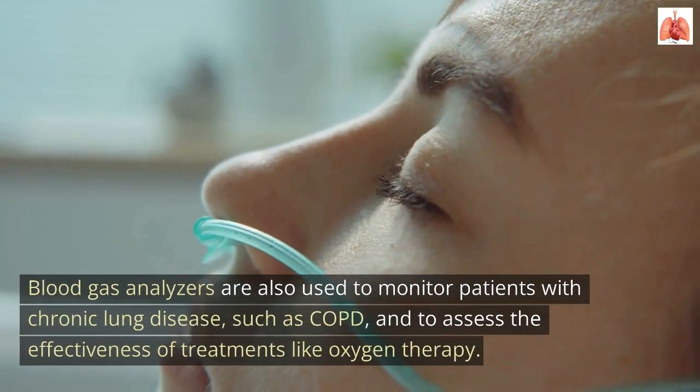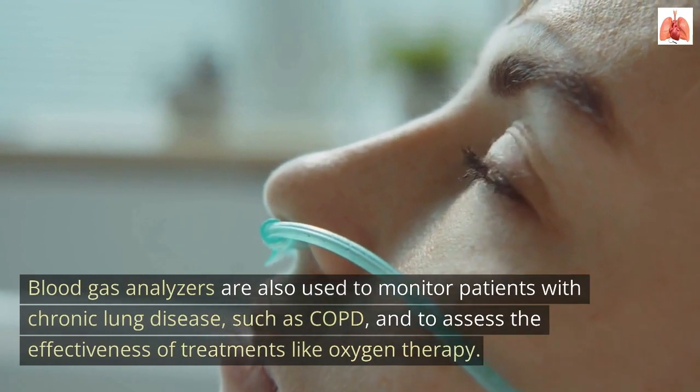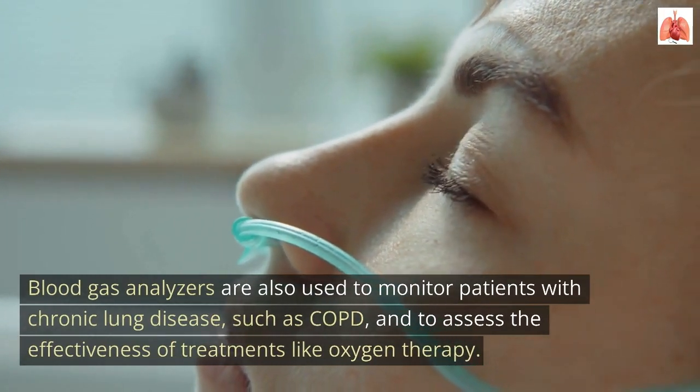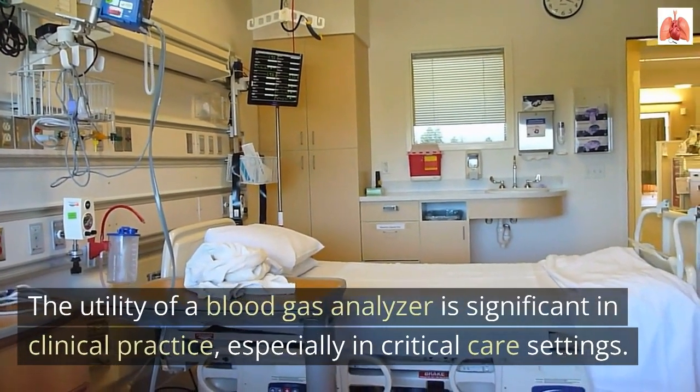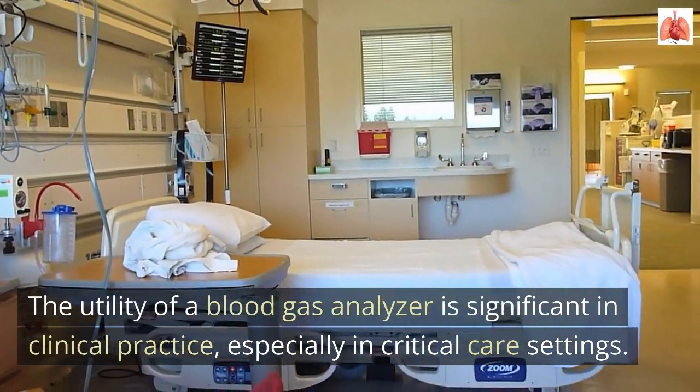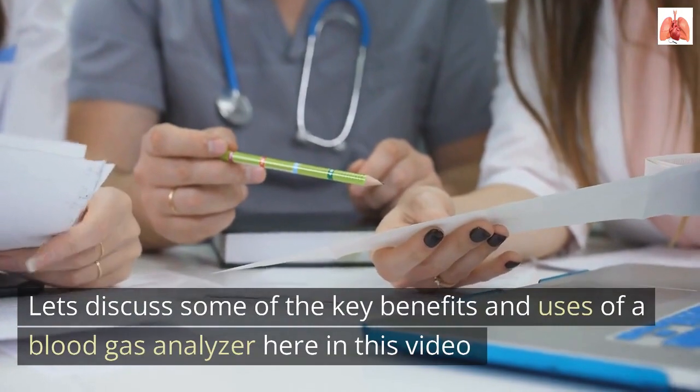Blood gas analyzers are also used to monitor patients with chronic lung disease, such as COPD, and to assess the effectiveness of treatments like oxygen therapy. The utility of a blood gas analyzer is significant in clinical practice, especially in critical care settings. Let's discuss some of the key benefits and uses of a blood gas analyzer here in this video.